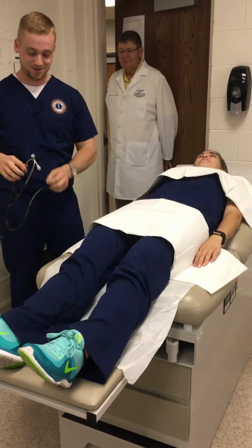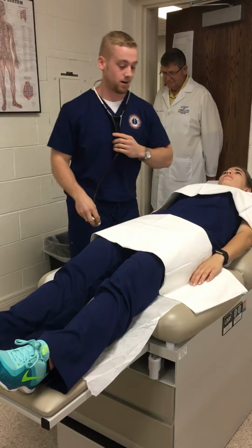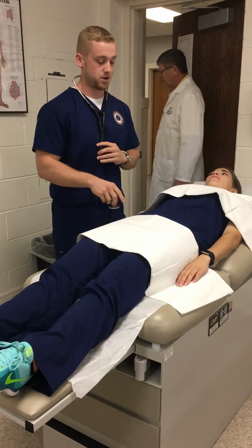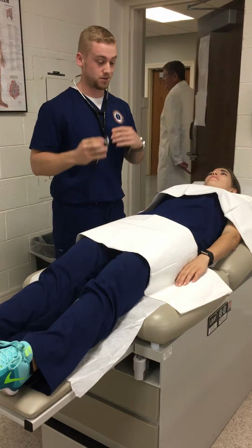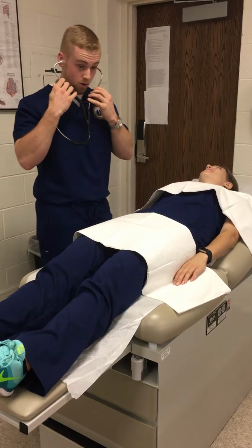All right, so now we're going to move on to auscultation. So it's important to do auscultation before you do percussion and palpation so you don't alter the frequency of bowel sounds. So we're going to go ahead and listen with the diaphragm of the stethoscope in the right lower quadrant.